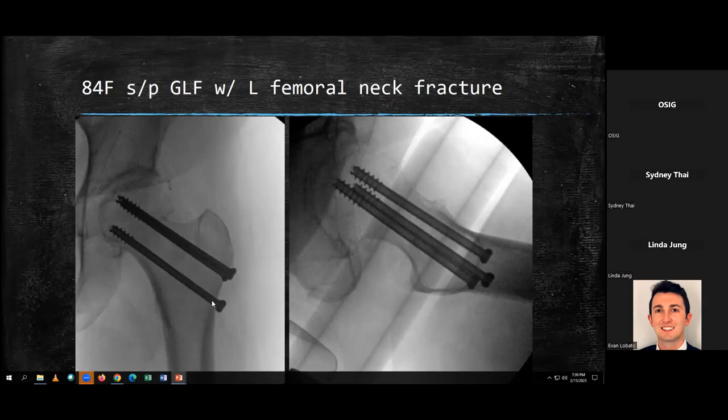And then the hole that you drill is inner diameter, outer diameter. So it's about the thickness from here to here. So the thickness of the bare screw, but a little bit thinner than the threads, okay? And so all of this part of the screw isn't what we call biting or purchasing the bone. The only part that is purchasing is here, okay? So that's the only part that has threads that can hold on to the bone.